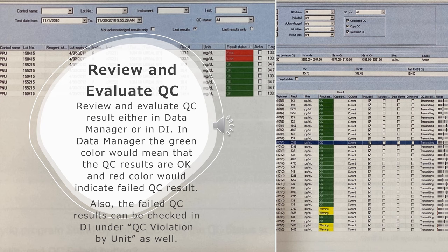Review and evaluate QC: Review and evaluate QC results either in Data Manager or in DI. In Data Manager, the green color means that the QC results are OK, and red color indicates failed QC result. Also, the failed QC results can be checked in DI under QC violation by unit as well.